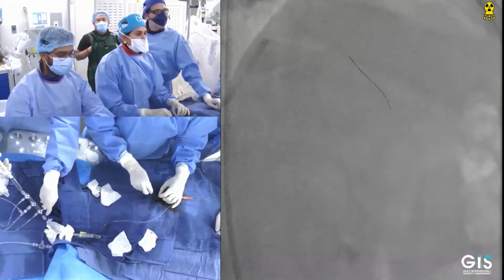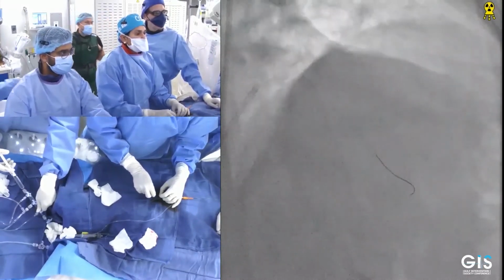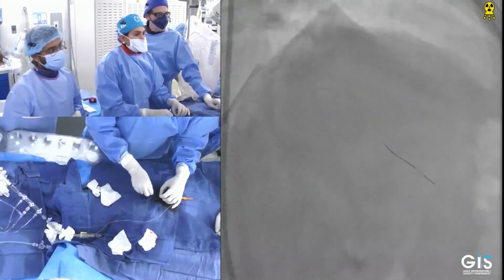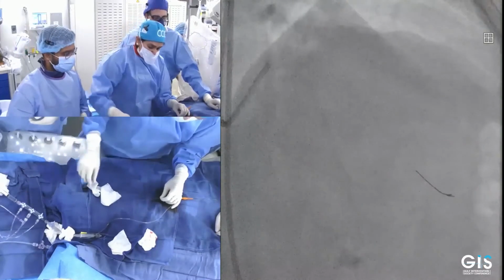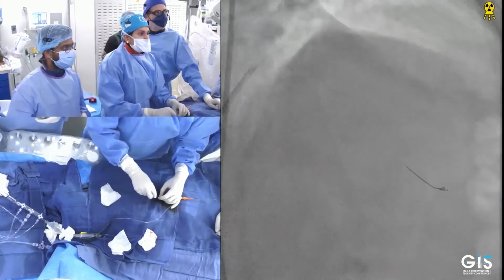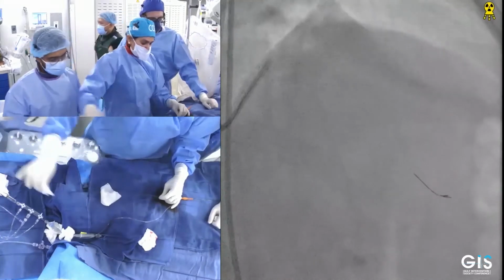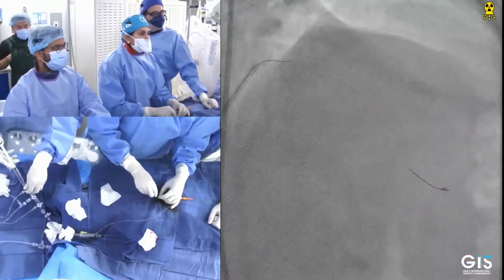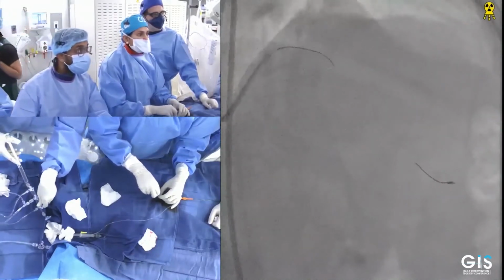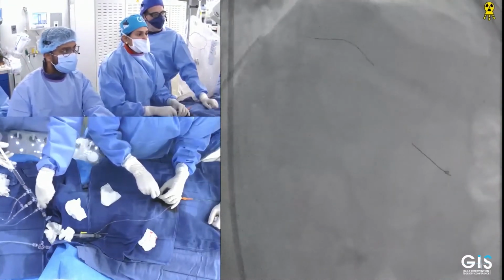So, Muhammad Subhi, you said you have the imaging already opened. You should have done LAD and diagonal. So if you want to go double stenting or one stenting. I did a short lesion in the mid diagonal. So I have to look either to make an FFR for the diagonal to see if it's insignificant, do one stent and see what's happening with the plaque shift. And you can end by kissing or provisional for the second. If you are suspecting some calcium in the diagonal, it's another story. So you have to do the same as what you did in the left main, in the LAD. Yes, so I do OCT both ways.